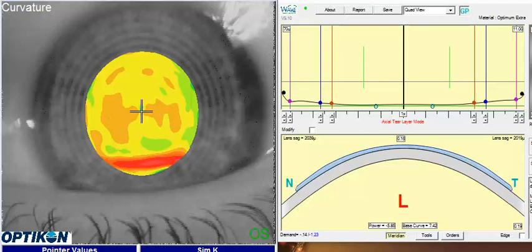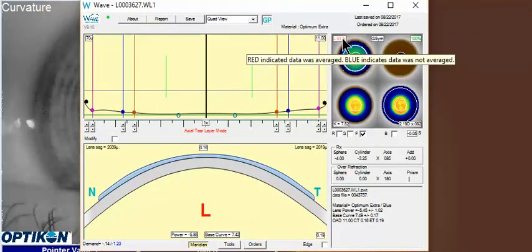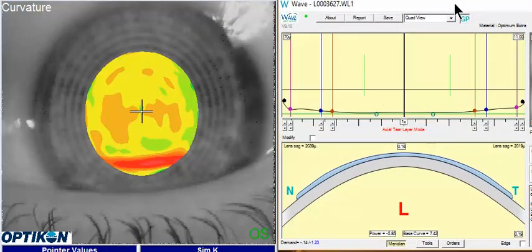I see from your request you're struggling with an unexpected over-refraction for this patient, for this lens. And when I'm looking at the designs, overall your design actually looks pretty good. However, I noticed when you designed it, you chose to average out the corneal astigmatism, and I think that may be creating a bit of a problem with the optics of this lens.